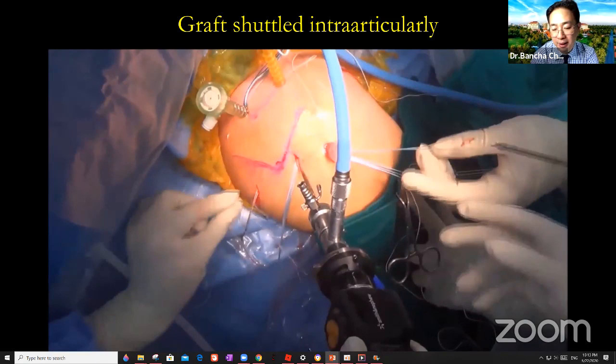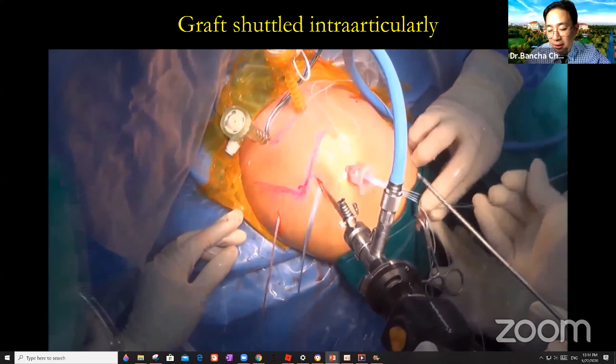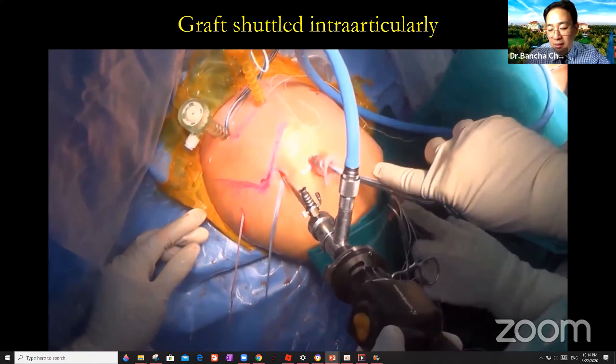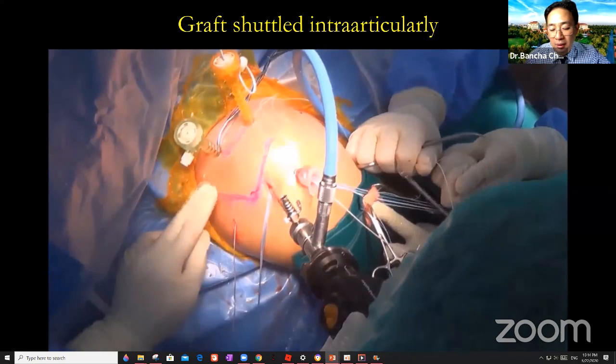So this cannula is the syringe, and I already cut it, so I can easily take it out. Yeah, it's not difficult. Okay, that way. Okay, the last one. Okay, that way. Yes. Good, now complete. Okay.